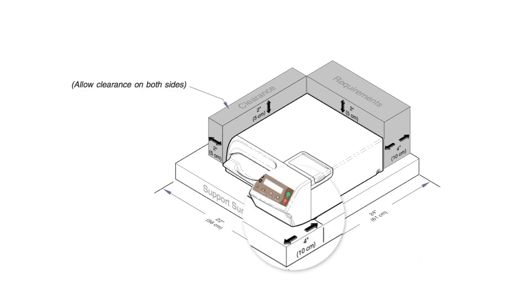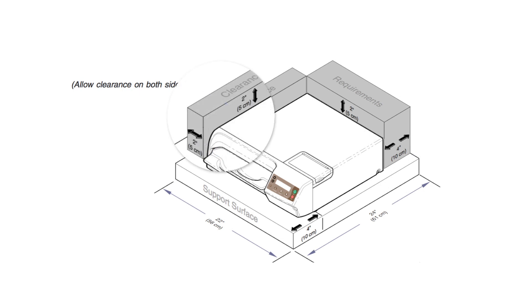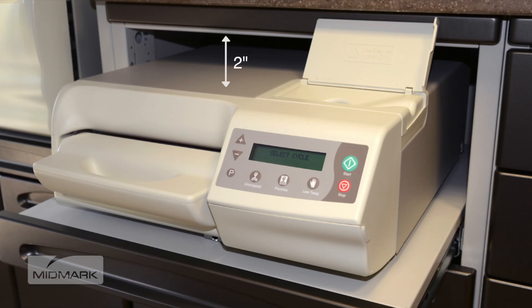Allow a 4-inch clearance from the front feet to the front of the support surface, 4 inches from the back of the unit to the back wall, and 2 inches on either side. If installing the unit beneath a cabinet, shelf, or overhang, a minimum clearance of 2 inches must be maintained above the unit. This is the minimum clearance for proper air circulation. However, be sure to allow access to the reservoir fill port located on top of the sterilizer.